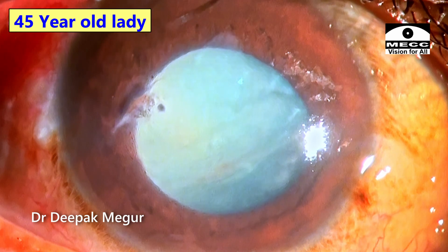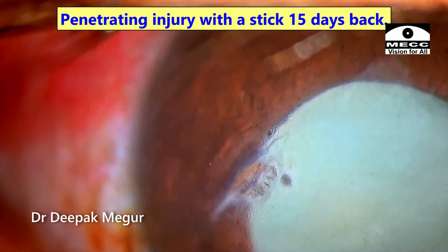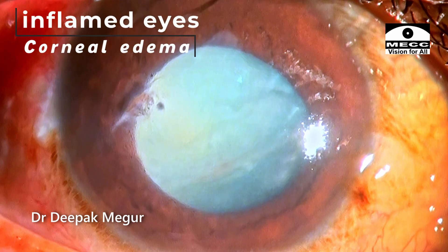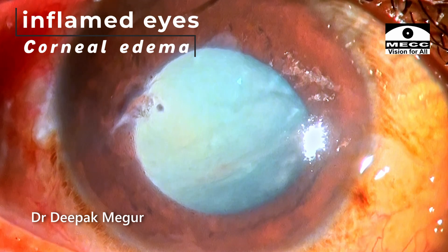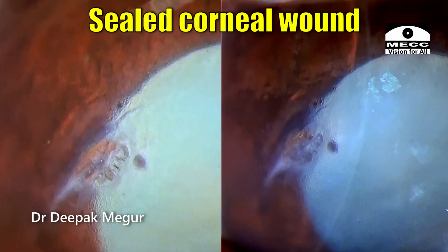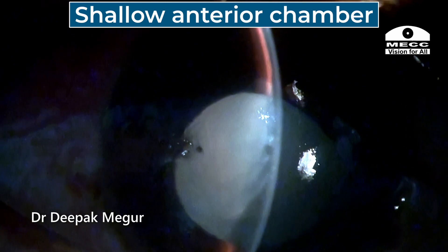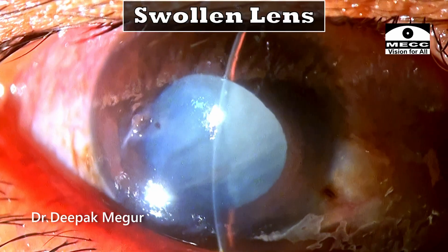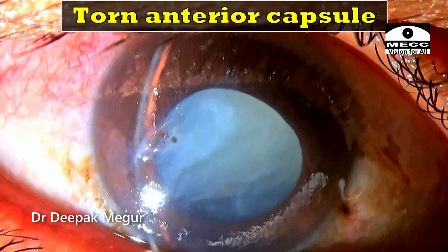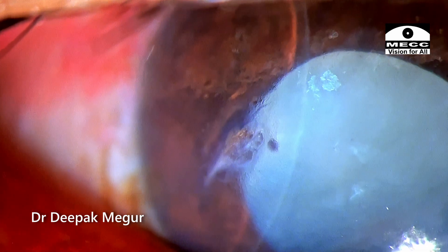A 45-year-old lady presented with a history of penetrating injury with a stick 15 days back. The eye is inflamed, cornea is edematous, this is the sealed corneal wound, the anterior chamber is extremely shallow, almost flat. The cataractous lens is swollen and there could also be a torn anterior capsule, which would be the reason for the swollen lens fibers.